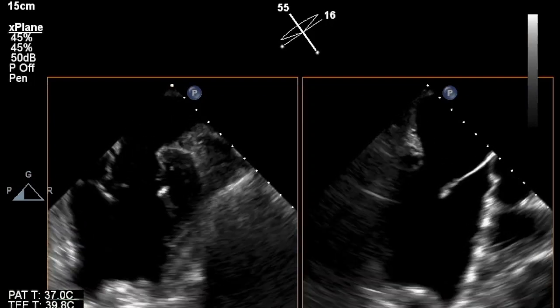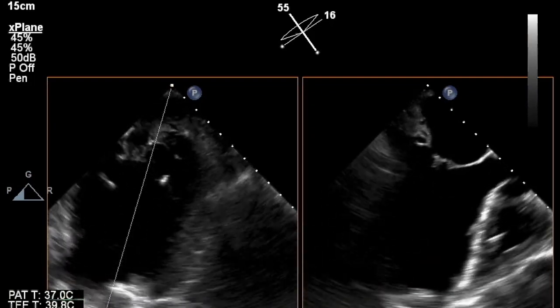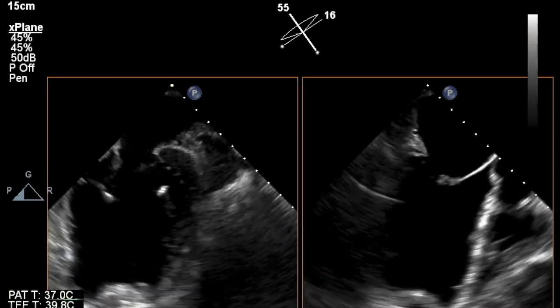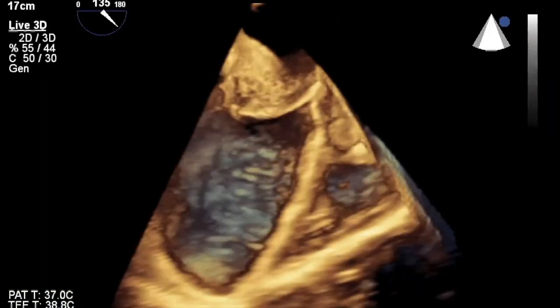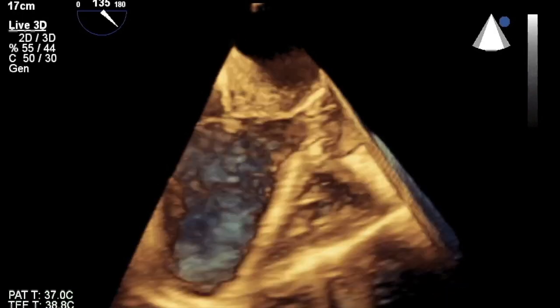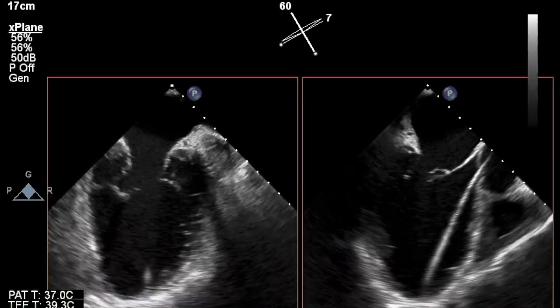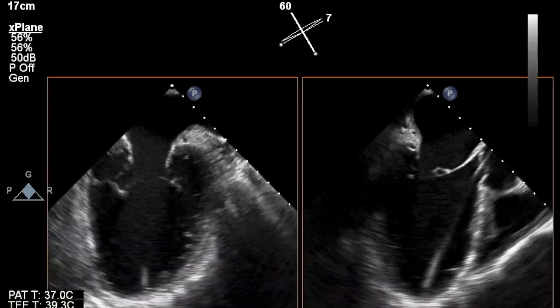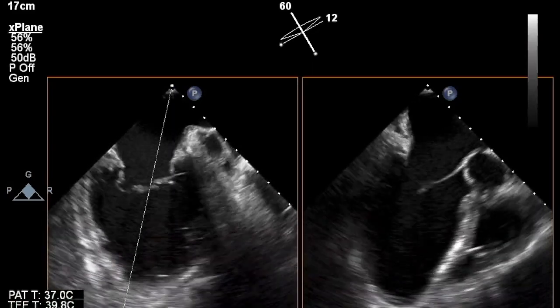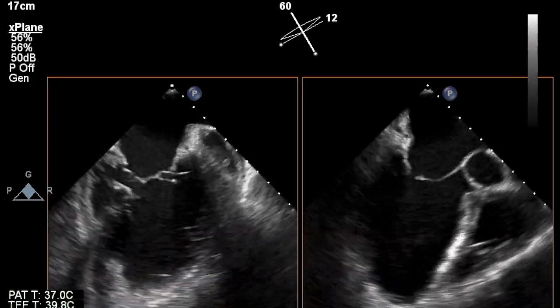The apical access is confirmed at the surface of the pericardium. You can see the dimpling or the indentation. The access apex is the apex in the center of the mitral annulus. This may not be the true apex. In this case, the access site is lateral and anterior. The indentation of the apex was clearly visualized on 2D and 3D.